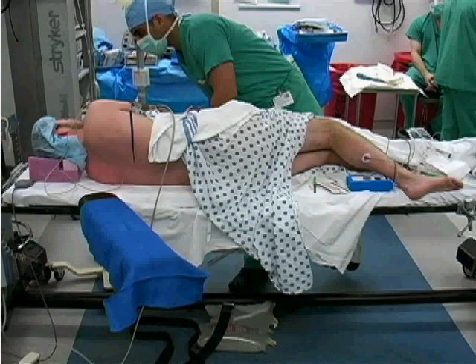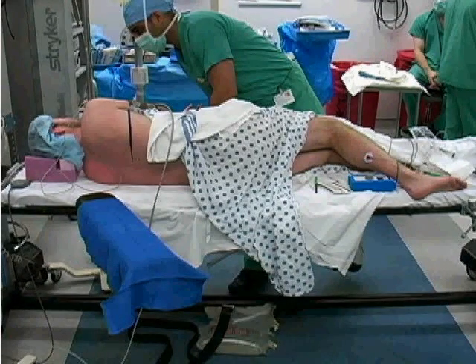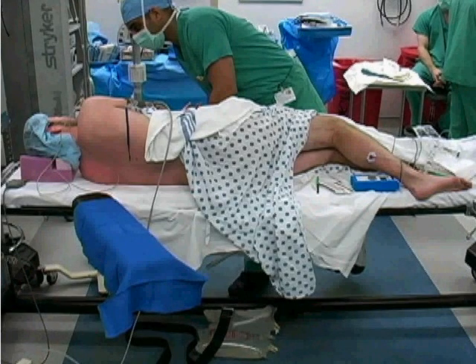The popliteal nerve block is a regional block designed to provide anesthesia for foot and ankle surgery. It is often combined with the saphenous nerve block to provide complete lower leg and ankle sensory loss.